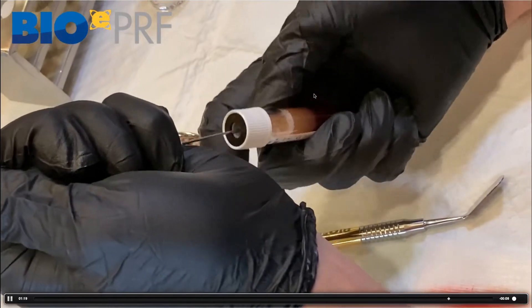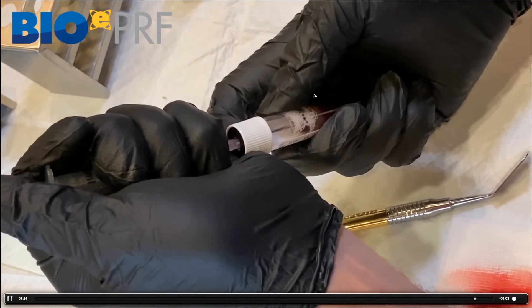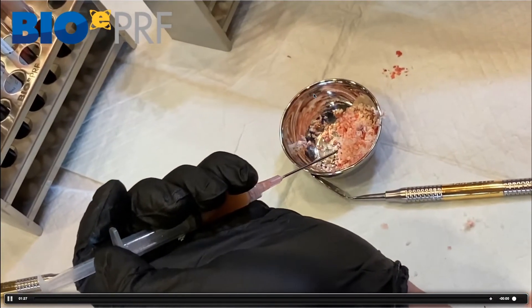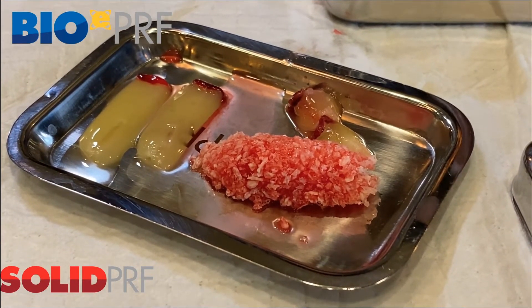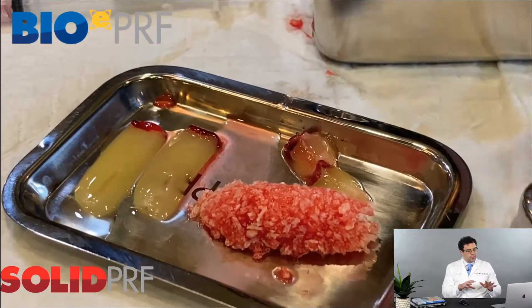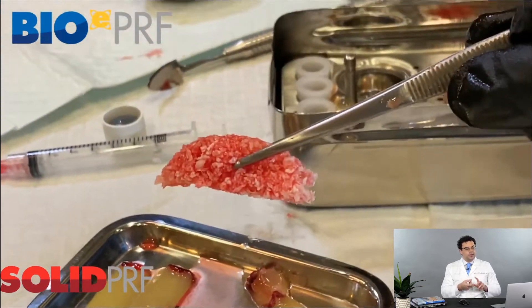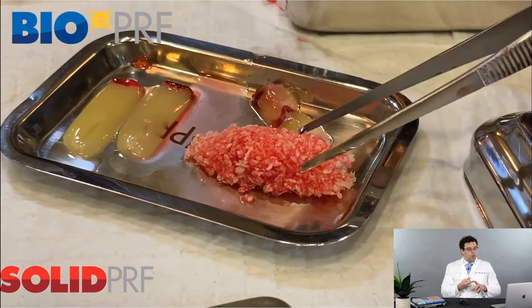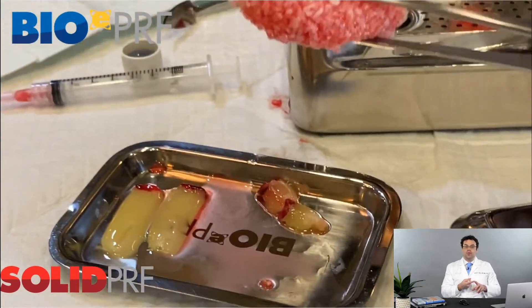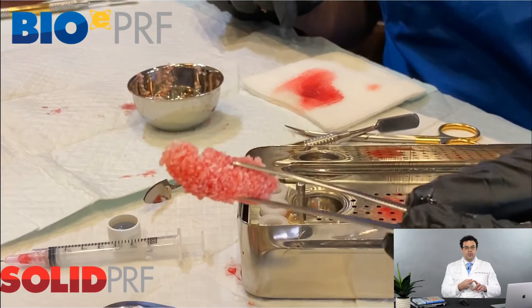If we don't have enough liquid, we can just grab more liquid platelet-rich fibrin and incorporate it to make the liquid platelet-rich fibrin. When the sticky bone is done, you should theoretically have a consistency that looks like this. If it doesn't, it's either that your bone grafting material is not of proper quality and may not have enough collagen, or it could mean that you didn't cut up one or two PRF fragments ahead of time, which is very important.